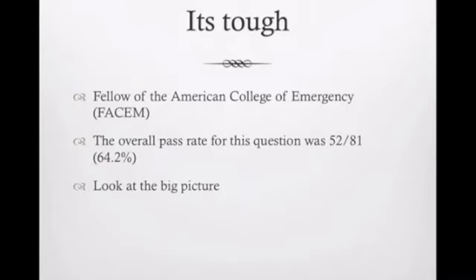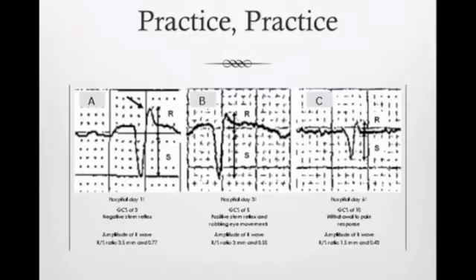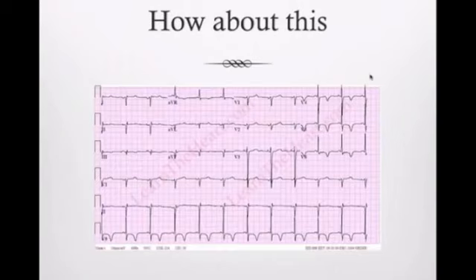So it's tough. You have to use your EKGs along with looking at your patient for your clinical diagnosis in these patients. So the TCAs, here is what we're looking for. Wide complex, large terminal R wave here. This is saying greater than 3.5, but we can say greater than 3 millimeters. All right, that's what we're looking for. Wide QRS, large terminal R wave in AVR. All right, so practice makes perfect.